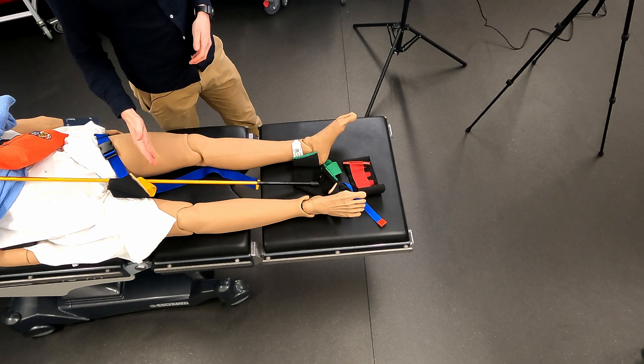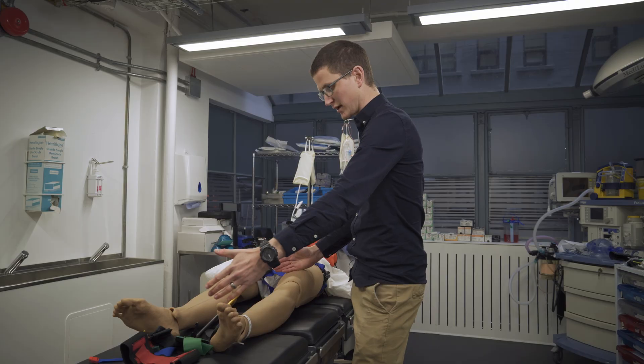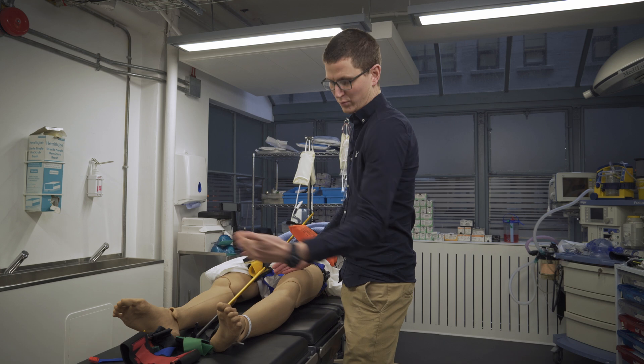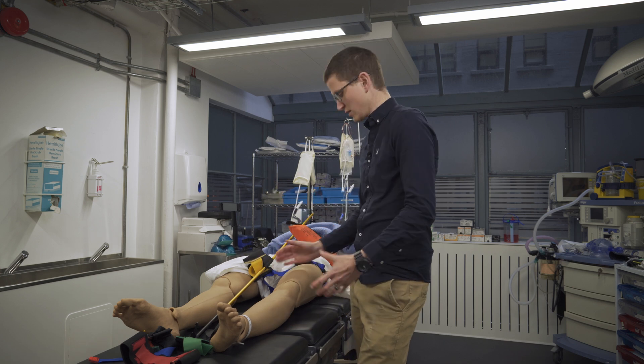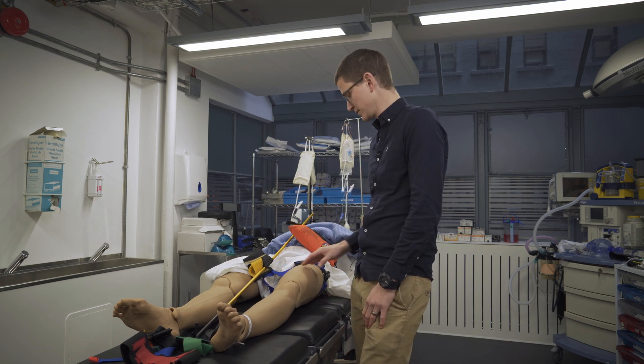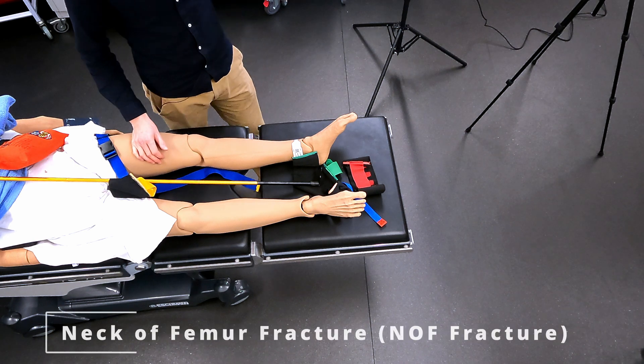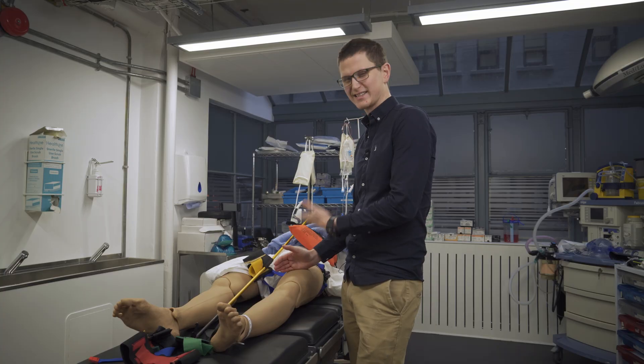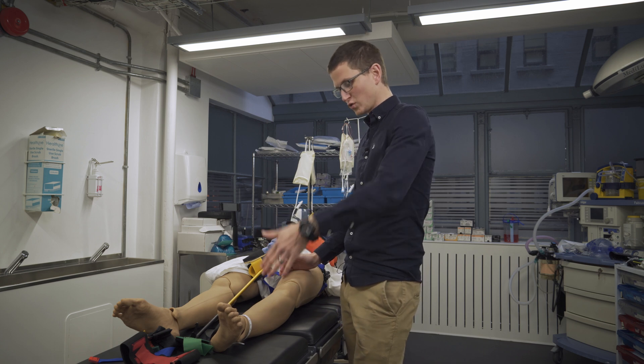How do we know if there is a mid-shaft femur fracture? We're going to see shortening of the leg — the injured leg will be shortened and rotated. The swelling will be in the middle of the thigh. If they have a neck of femur, you're not going to see that mid-shaft swelling. This also takes significant force, with that shortening and rotation.